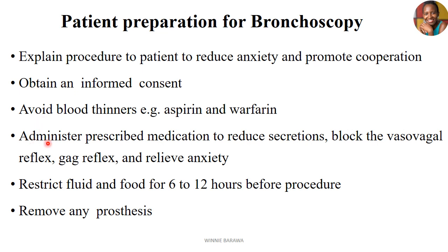Then it's important that you administer prescribed medication that helps us to reduce the amount of secretions in our airways. We also need to administer medications for blocking the vasovagal reflexes. These are part of the reflexes that guide our peristaltic movements and guide our swallowing movements in the GIT system. So we need to have that limited. Then there's the gag reflex and also relief of anxiety.